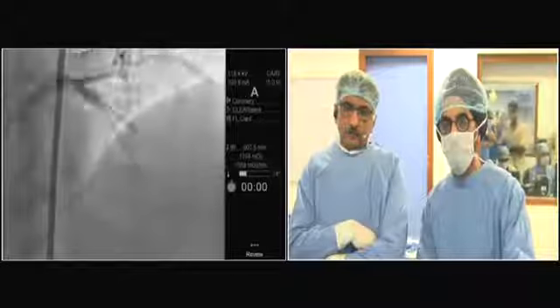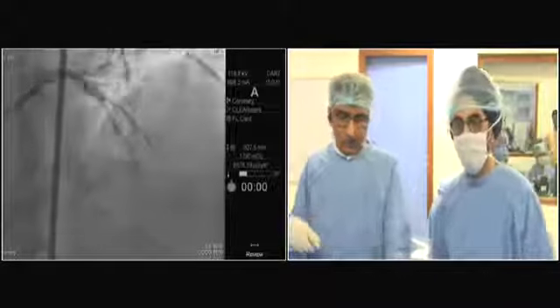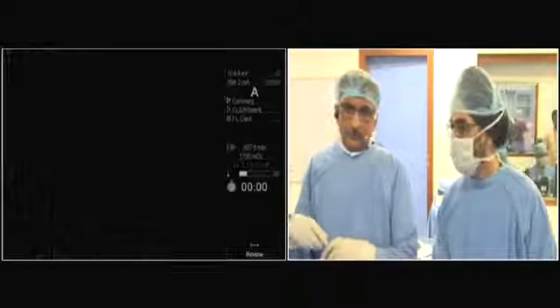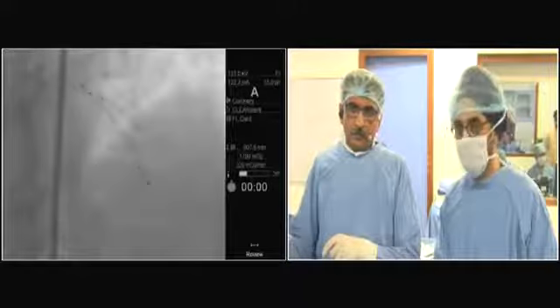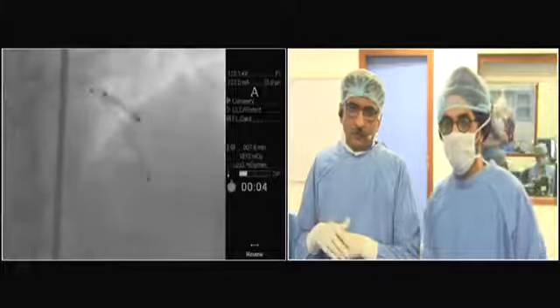I just wonder if any other panelists wonder whether the choice of stent may be important, whether using a self-expandable stent, in these cases with large discrepancy, might take away some of the issues with the conventional stents.